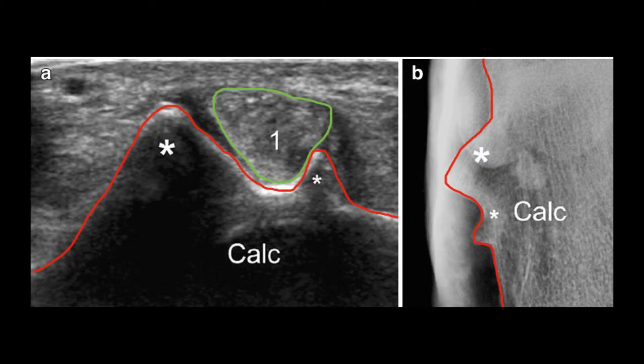This is a great axial image to assess the peroneus longus groove of the calcaneus. You can also note that the peroneal tubercle is hypertrophied in this case, and you can use the x-ray on the right to correlate the two images together.